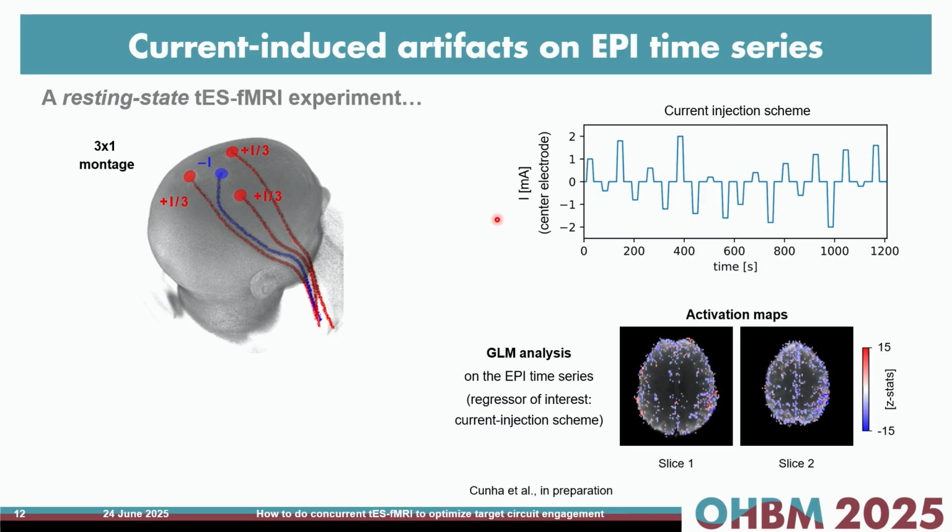We ran a very simple GLM analysis using the current injection scheme as regressor, and to our surprise, we got these beautiful activation patterns.